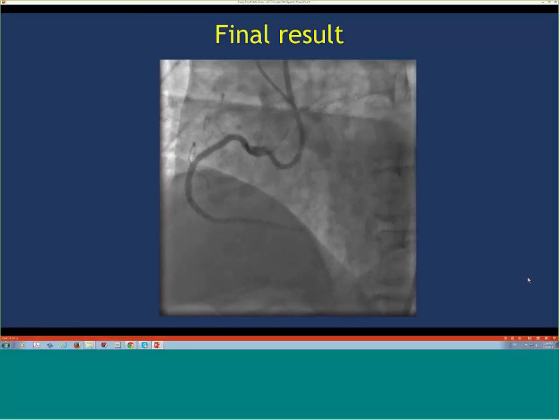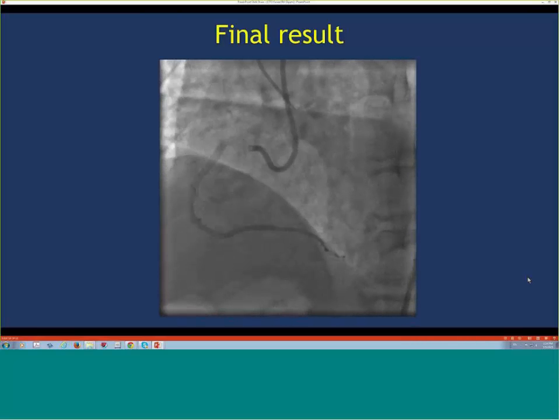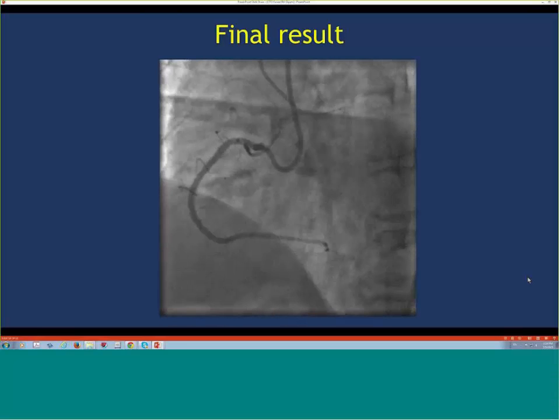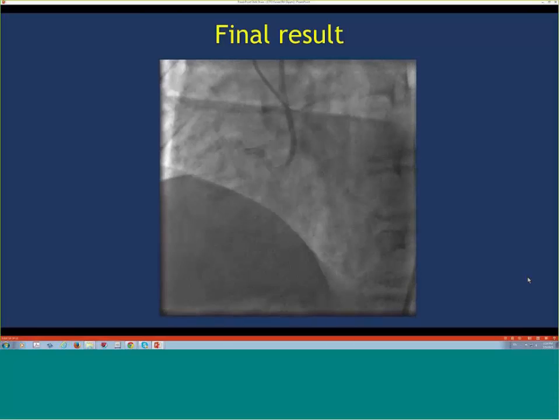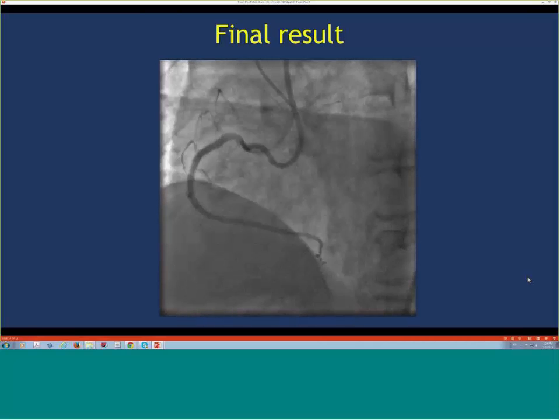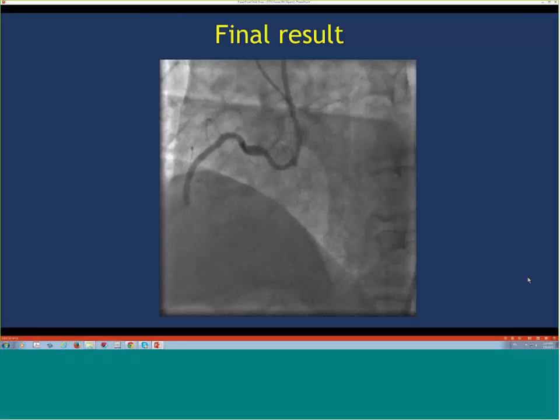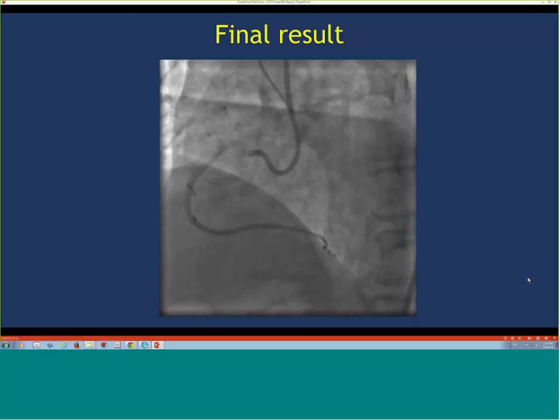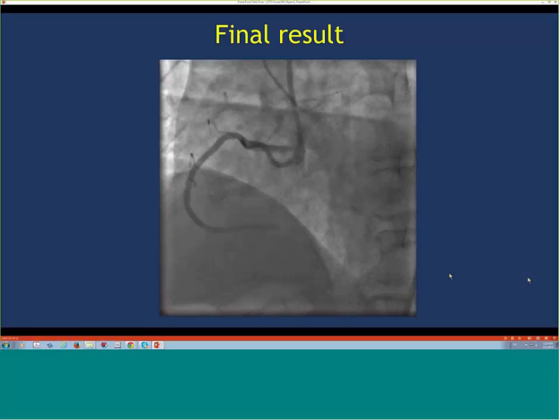Now, just curious, did you shorten the RotaWire, or you just put it the way it is? You didn't do anything to it. Say it again. What was the question? So some people shorten the RotaWire. If it's a very short space, probably not in your case, they cut a little bit of the tip of the RotaWire to have it so you can go further down and avoid the issues with clipping potentially the tip of the wire. But it looks to me like here you had a lot of space distally, right? So that was not an issue. Yeah, no, we just kept the RotaWire as it was, and after we did the rotablation, we used the FineCross again and used the regular wire to finish off the case.